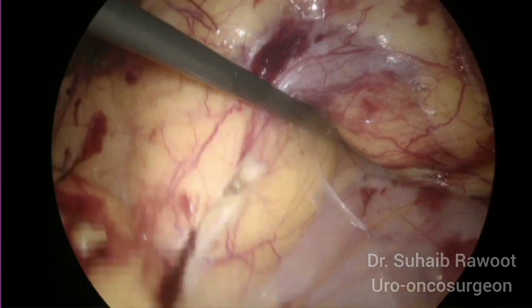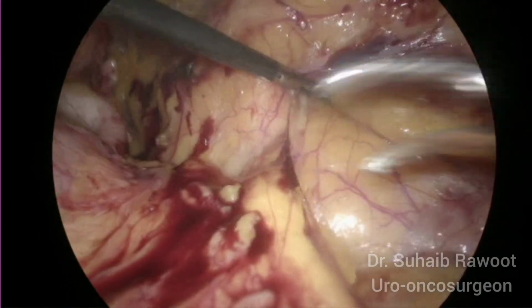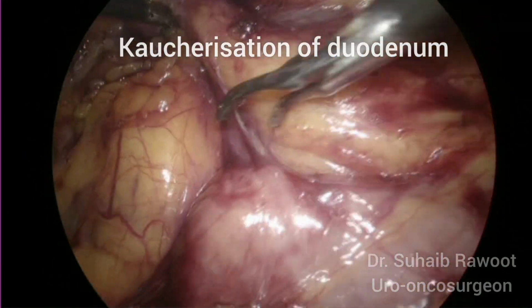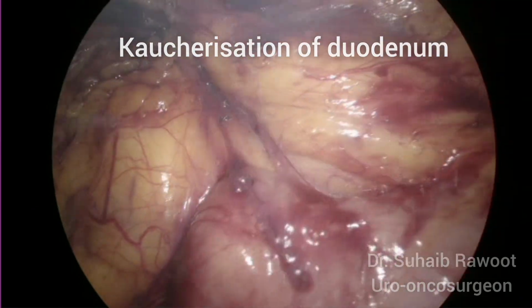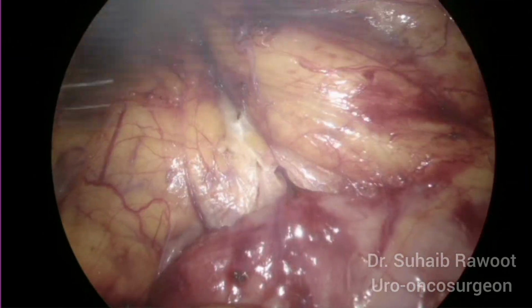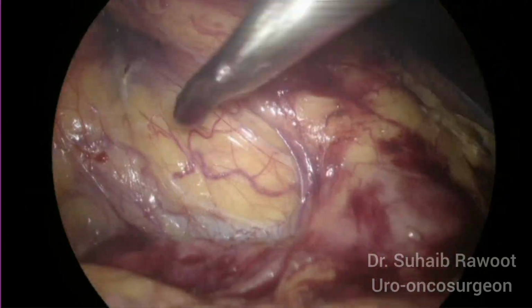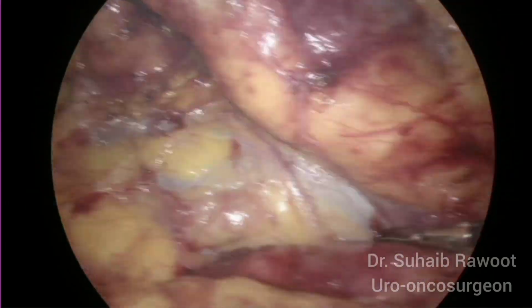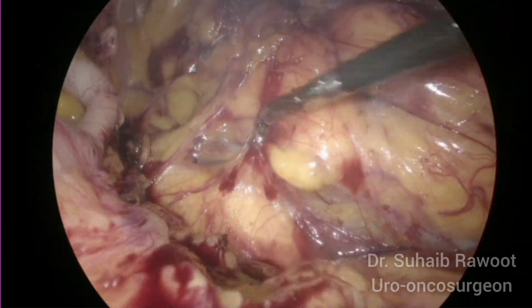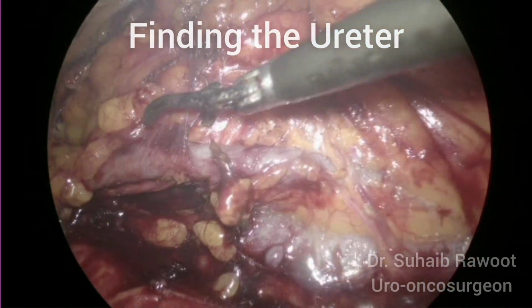So once you drop the colon, the next step is kocherization of the duodenum. So this is the duodenum, and from here we start dropping the duodenum below. Just keep a 1 to 2 mm distance above the C-loop of the duodenum so that you don't inadvertently injure the duodenum. Now the third step is finding the ureter.